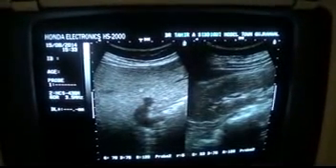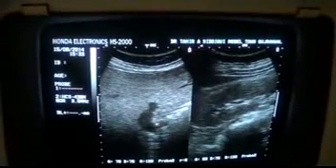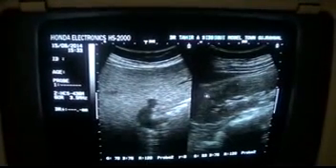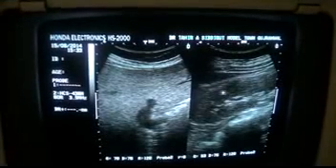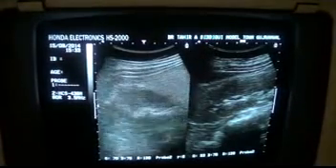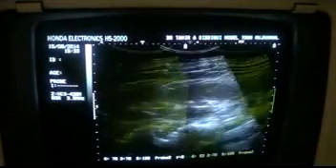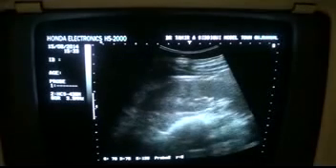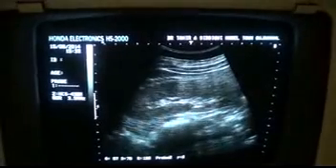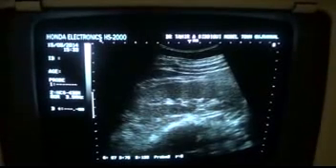There is diffuse increased parenchymal echogenicity of the liver. You see periportal echoes are attenuated, and the parenchyma of the kidney is seen normal. Whenever needed, we can also go to the prone position to evaluate the kidney. Now this kidney is normal. There is nothing wrong with this kidney, and there is no calculus. The parenchymal echogenicity is absolutely normal.